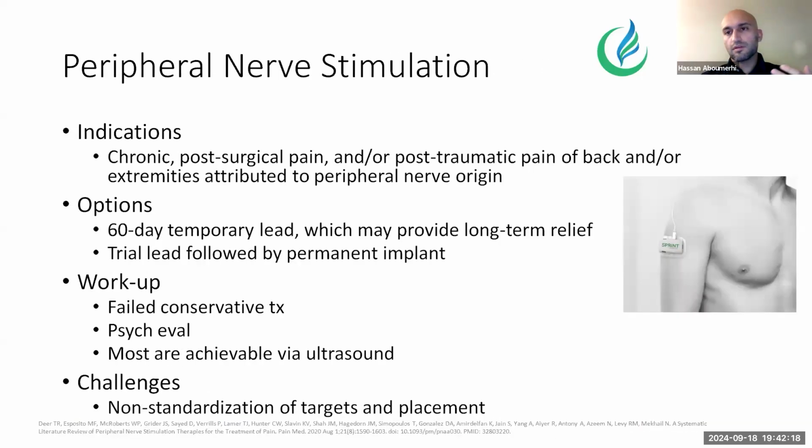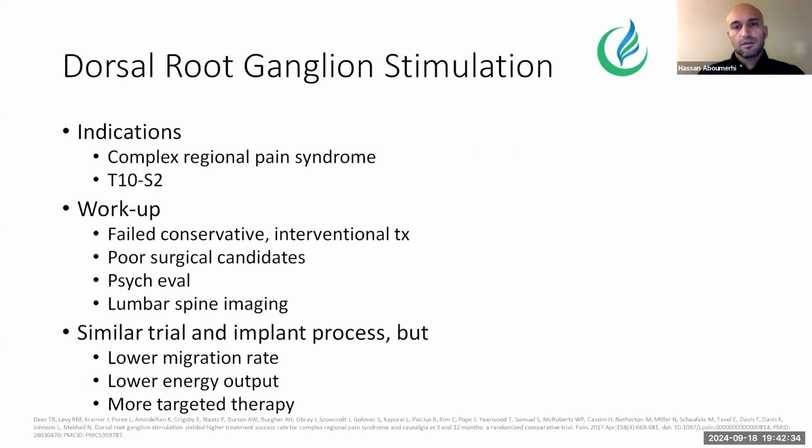And there's a theory of whether or not there's also retrograde stimulation. So you place a peripheral nerve lead, and it helps pain that's more proximal to where the stimulation is occurring. So there's definitely room for continued innovation in the field.